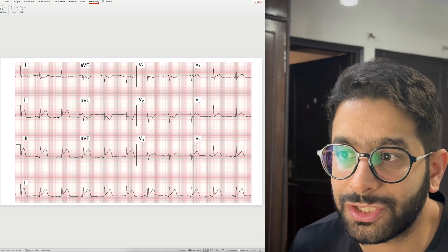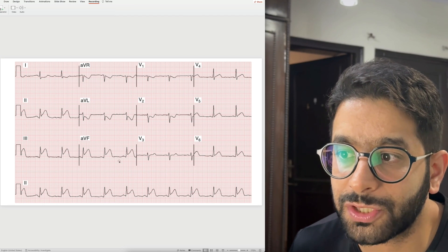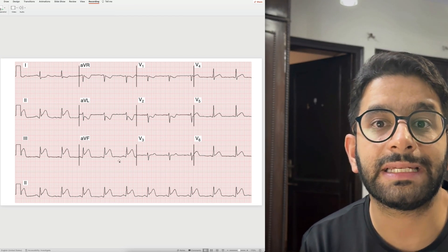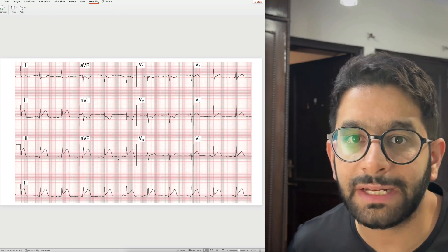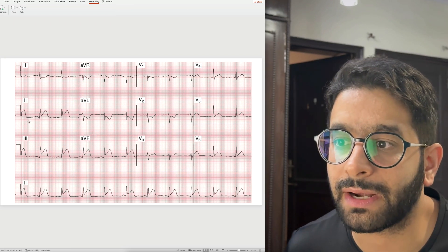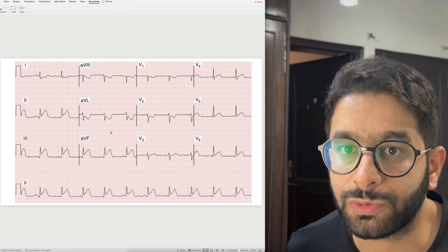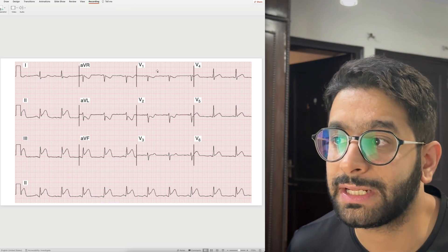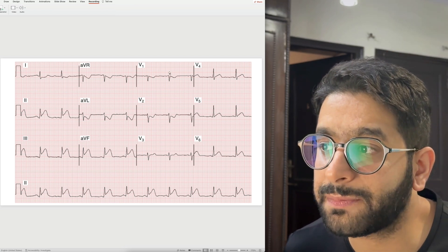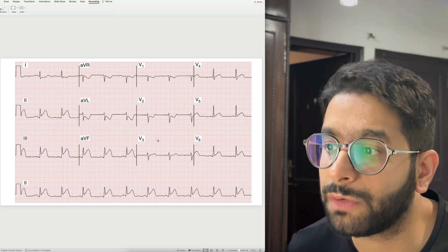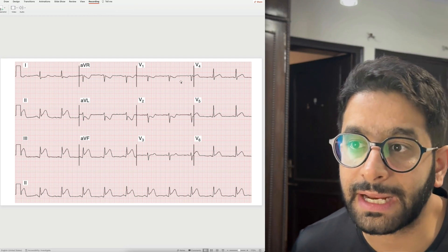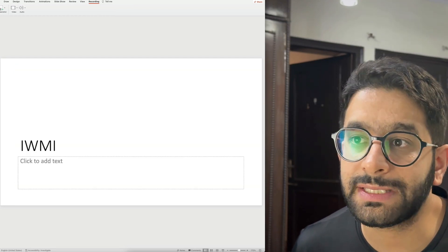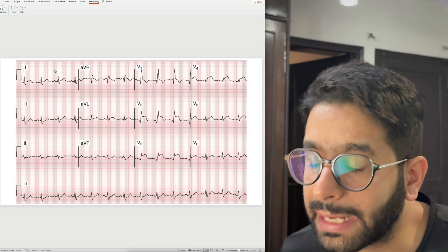You can also appreciate ST segment depressions in the mirror image leads — the high lateral leads, lead I and lead aVL — have depression. So this is inferior wall ST elevation myocardial infarction. Remember, ST segment elevations occur in different territories: inferior wall MI occurs in leads II, III, aVF, while anterior wall MI would show elevation in the anterior precordial leads V1 through V4 or V6, as we'll see in the next ECG.